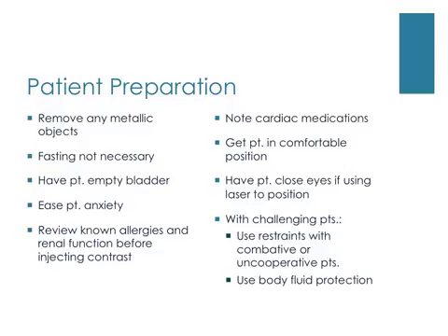Have the patient close their eyes if using a laser to position. This is extremely important on CT head images and maybe the neck as well, if that laser, the positioning laser, will interact with the eyes at all. With challenging patients, you need to sometimes use restraints with combative or uncooperative individuals. And you'll also sometimes have to use body fluid protection such as gloves, masks, and gowns.